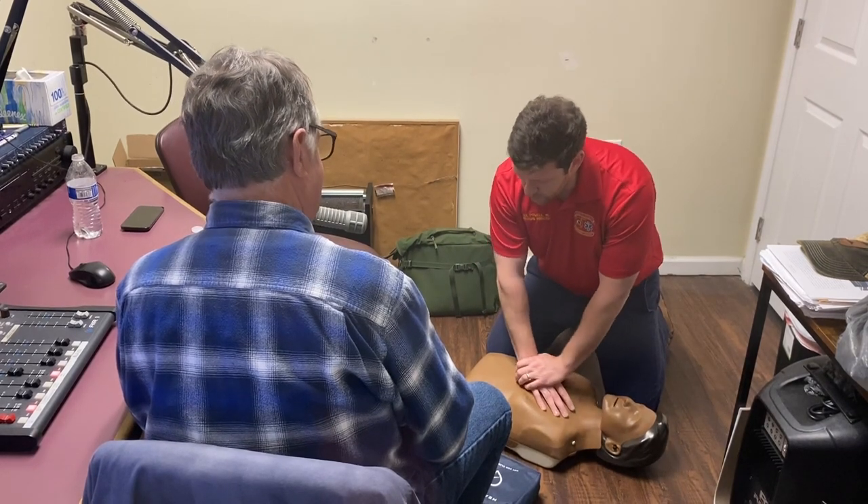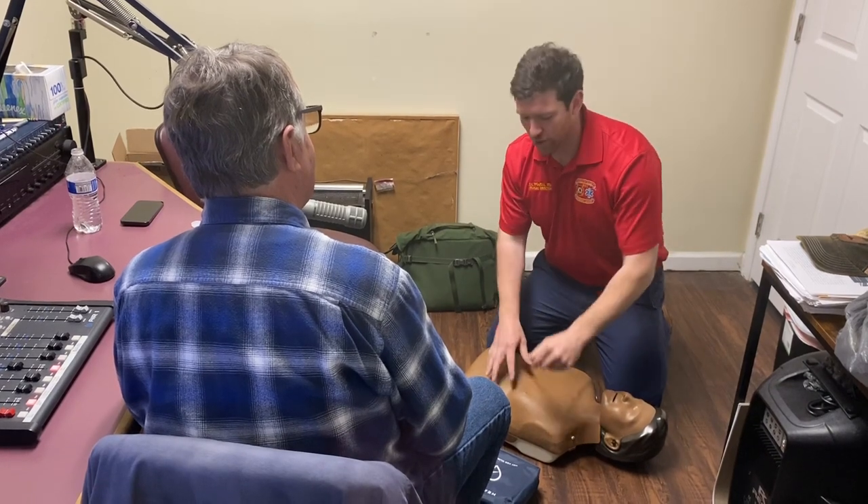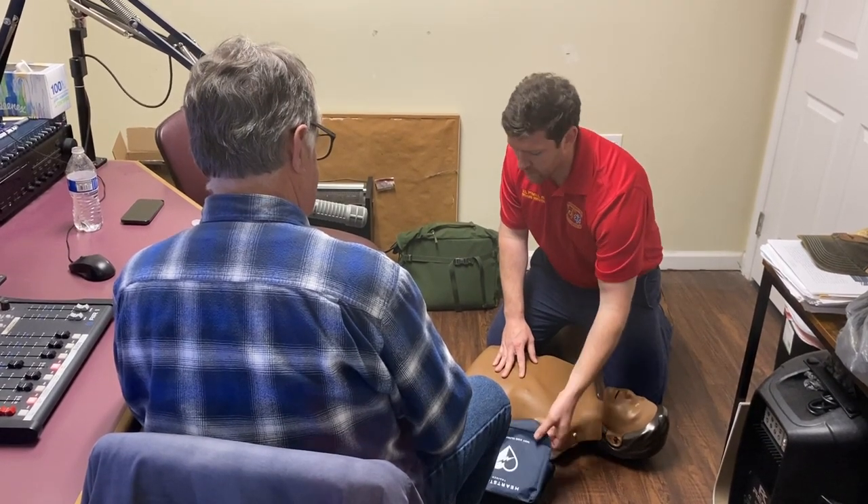So I've started chest compressions. I'm doing compressions, I'm calling for help, calling for bystanders — go get an AED. You know what an AED is because you've listened to this radio show. An AED is an automated external defibrillator.